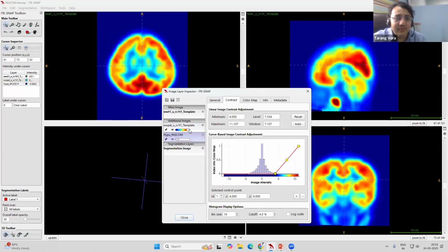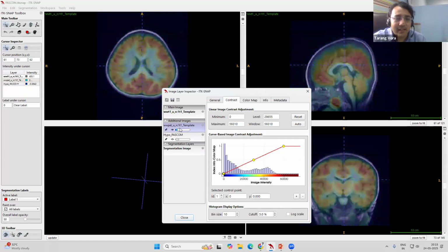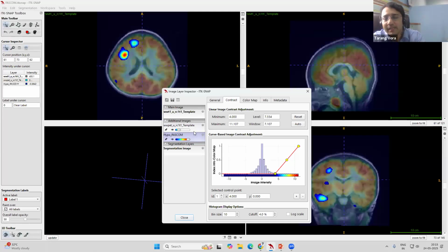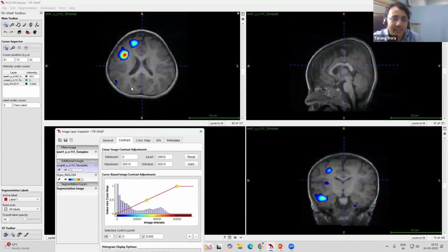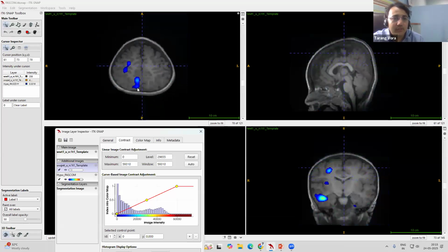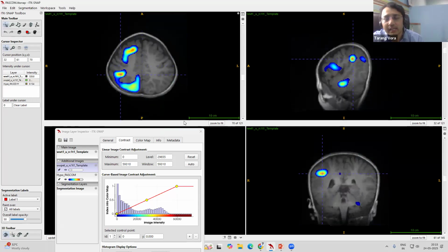And then we have the PET scan that is merged with the MRI to give us a better idea. And then we have something called PASCOM, which highlights the areas which are abnormal or having a hypometabolic pattern compared to the contralateral side. So this is the PASCOM, and of course it's going to show multiple areas of hypometabolism. But we were interested in this area because it was correlating with the EEG. The area of hypometabolism here as well as anteriorly is nothing but the spread of the seizure.